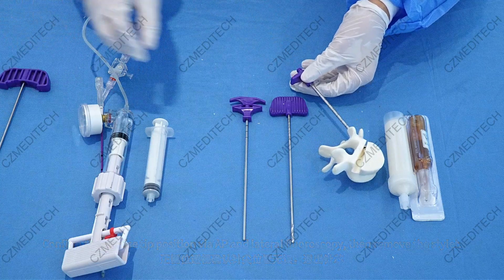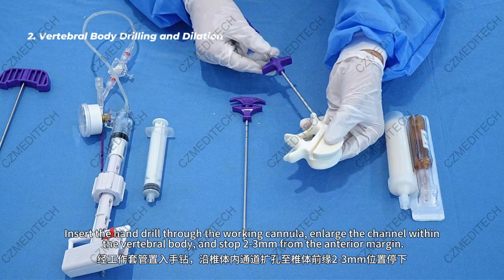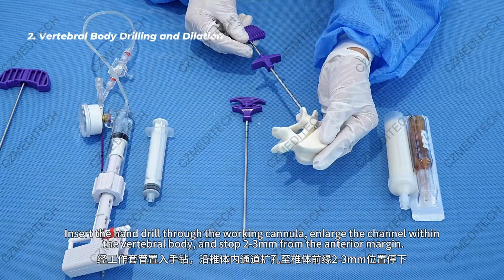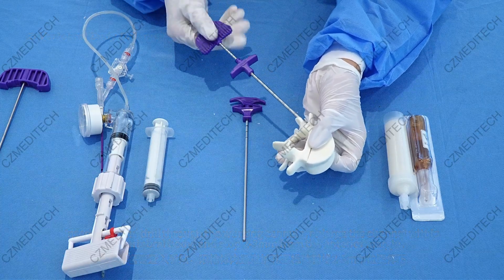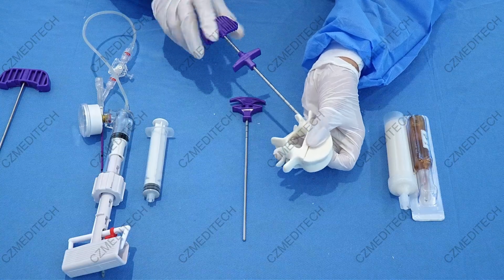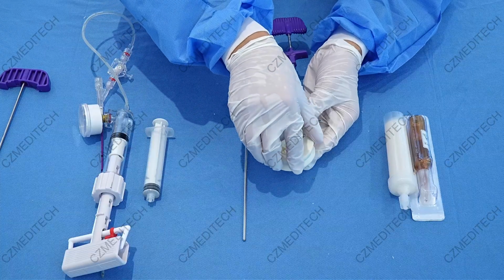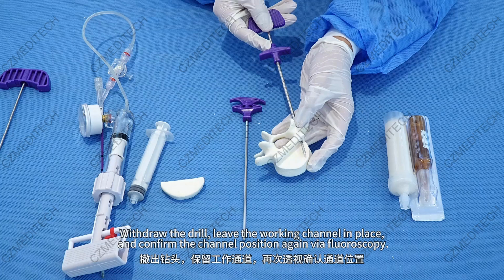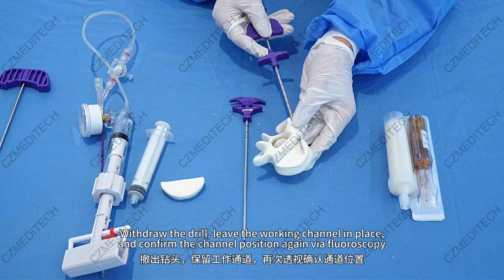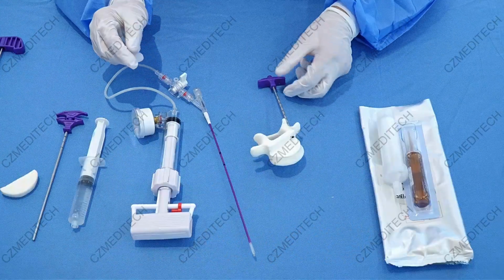Then remove the stylet and insert the hand drill through the working cannula. Enlarge the channel within the vertebral body and stop 2 to 3 mm from the anterior margin. Withdraw the drill, leave the working channel in place, and confirm the channel position again via fluoroscopy.